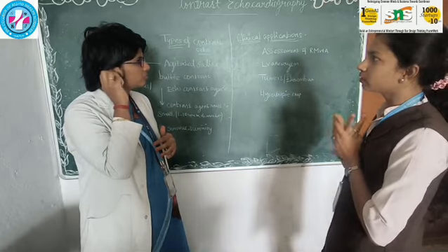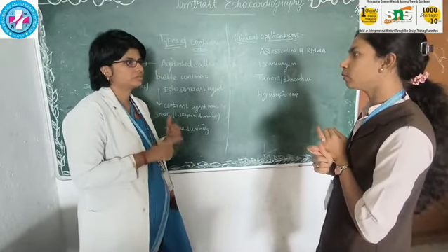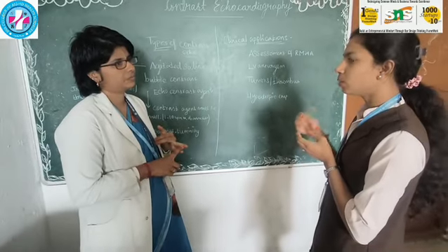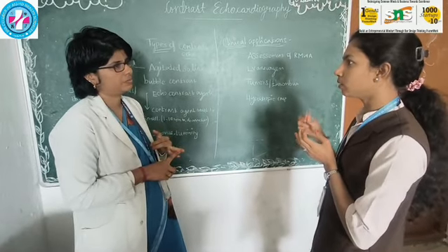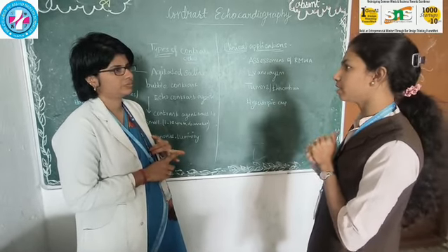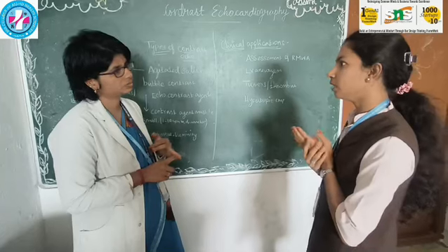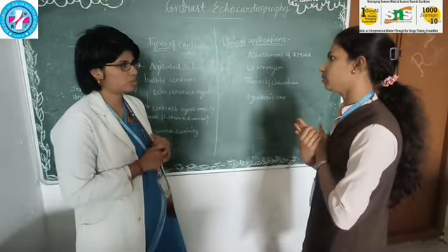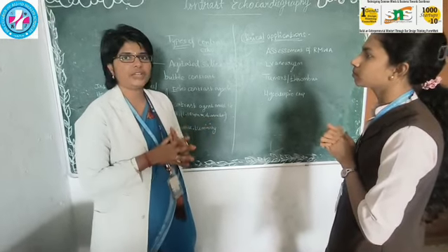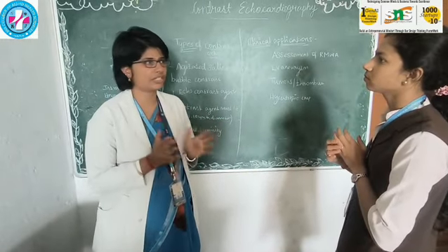There are 2 types of contrast echo: one is agitated saline and the other uses contrast agents. Okay. And in contrast agents, agents of 1 to 10 micrometer diameter will be taken. Examples are Luminity, Sonazoid. So here in India we are using only normal saline.